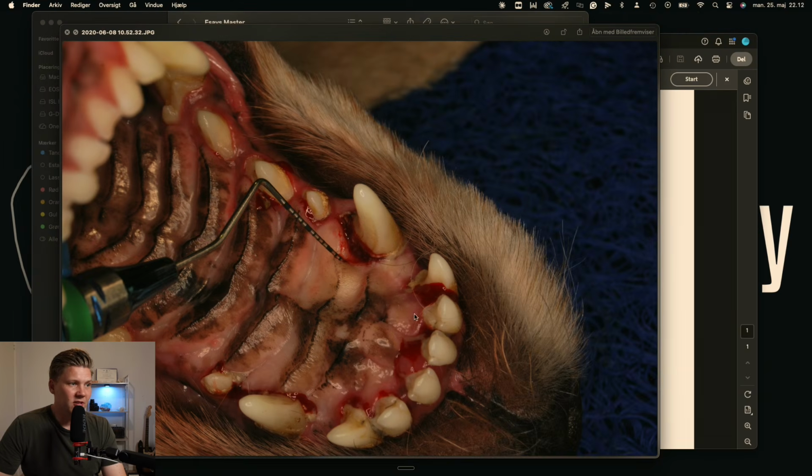And you can see right here, there is also a palatal defect, so a palatal pocket right here with some attachment loss. There's going to be calculus down here and lots of pus. These are quite forgiving actually. In many cases, if there's not yet an oral nasal fistula, then you can go down and do open root planing. So you take your curette and you scrape all of this calculus and diseased tissue out of this pocket.